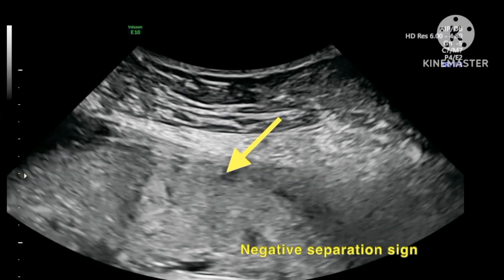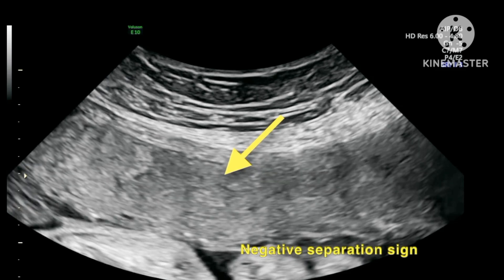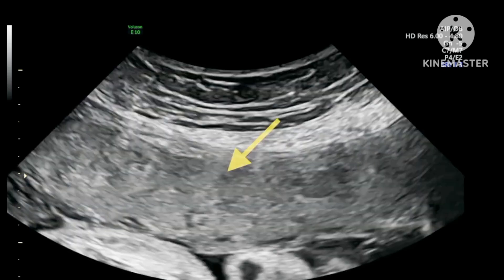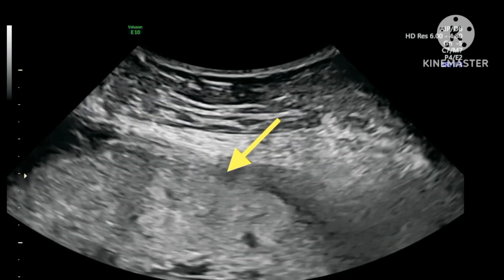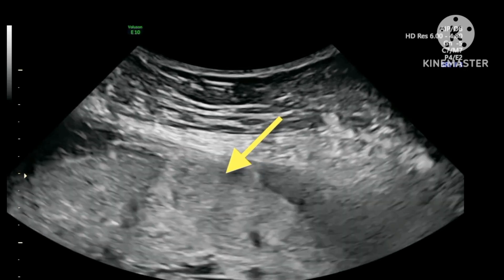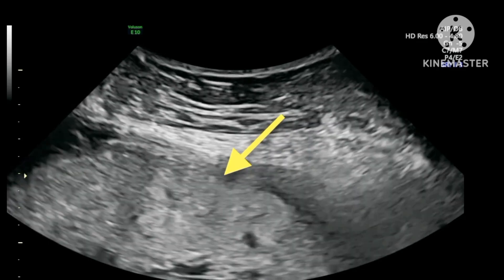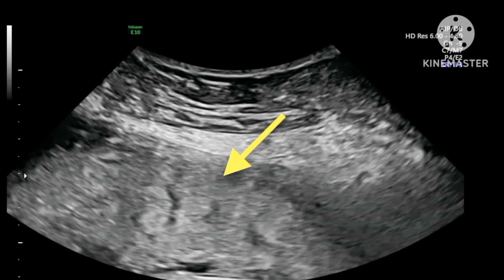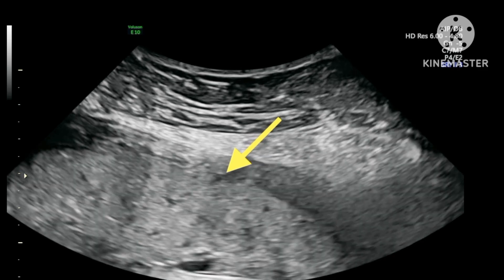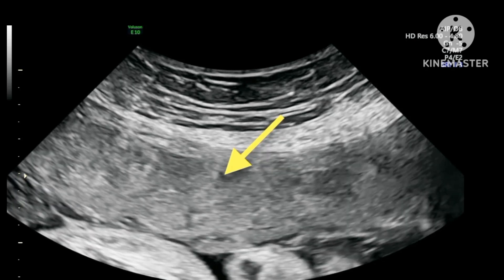This is an example of a negative separation sign. The arrow is pointing to the area between the myometrium and placenta. You can see when the probe pressure is applied and released, there is no clear zone becoming apparent, and the placenta is not moving separately from the myometrium. The important thing here is that both structures are moving as one. There is absolutely no separation between either of them, and both structures are moving as one.